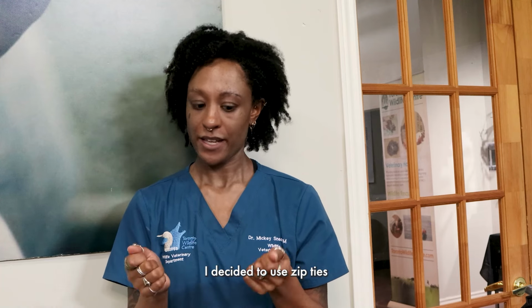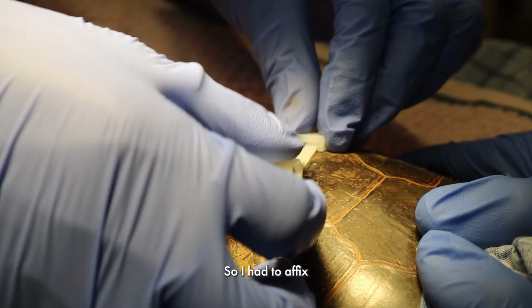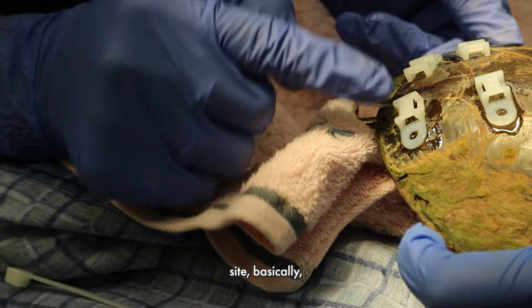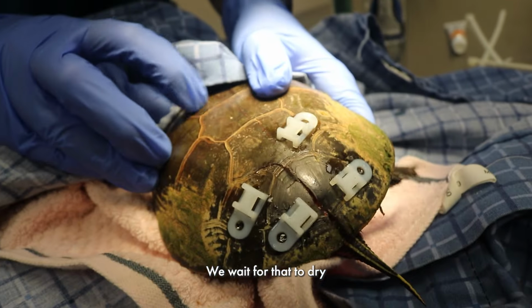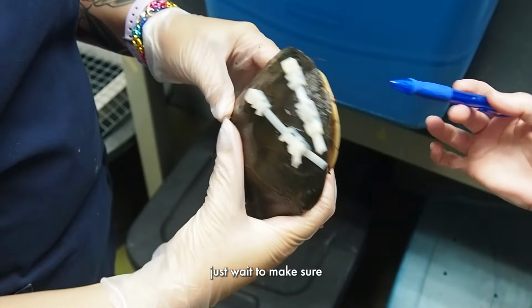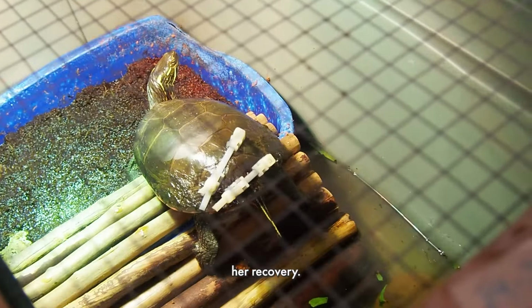Basically, we look at how the fracture is aligned and how we can pull it together. So in this case, I decided to use zip ties, which are a really clever way of being able to pull edges together so that they bind and heal properly. I had to affix two fixators on the front and the back of the fracture site so I could pull all the edges together. We fixed it with an epoxy that's very safe for the turtle shells. We wait for that to dry, and then the zip ties go in. It basically creates some tension to close and glue the edges of the fracture together. Then we just wait to make sure that it holds and it dries, and then she can go back into her recovery.